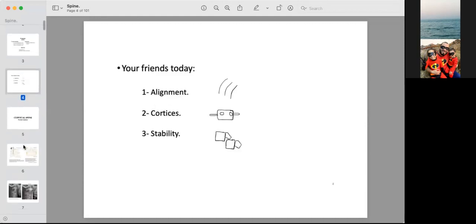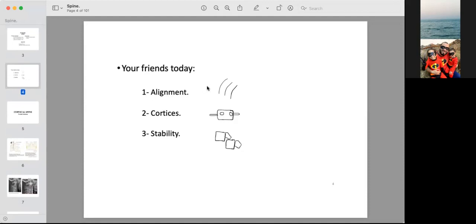Our key tool today will be the alignment of the vertebrae. In every study, there are three lines we should track: the anterior, middle, and posterior lines. We should also trace every cortex for each bone. Most importantly for emergency cases, we will check for stability and spinal cord affection.